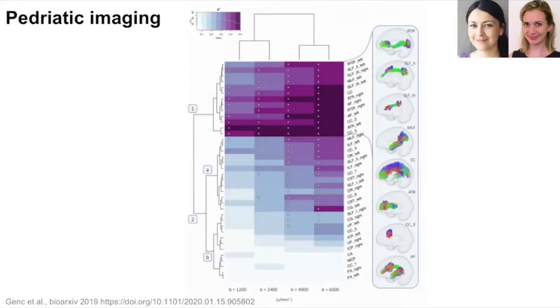This is based on spherical deconvolution techniques, where you try to look only at the intra-axonal space and estimate the fiber density per fiber population. This was also proposed to work in crossing fiber areas.